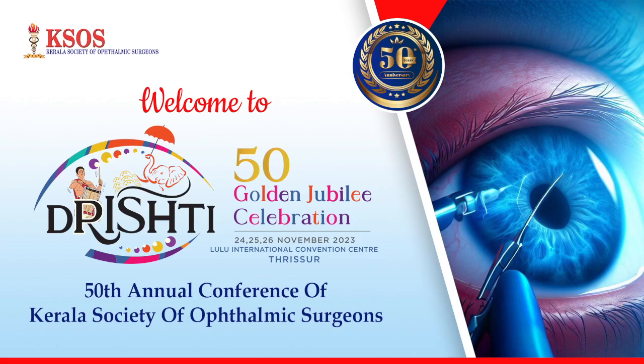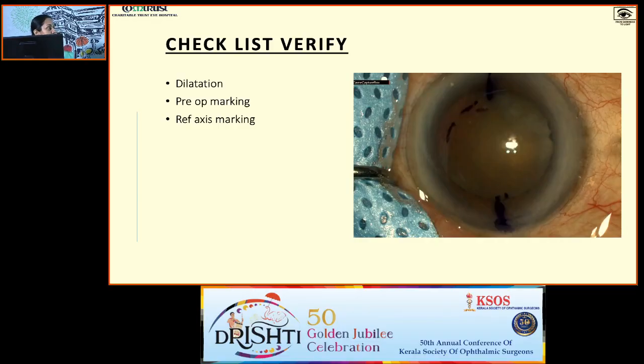Now we will see what the surgical techniques for a toric IOL are. Once you get the patient in your OT, after the marking, see that the markings are very clear and check the dilatation. If it is a well dilated pupil, your phaco part is easy and final axis alignment of the IOL will be easier.